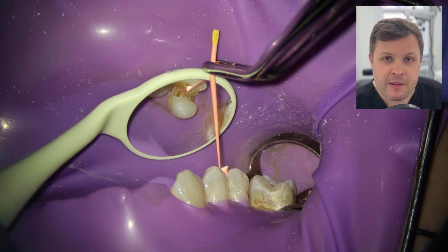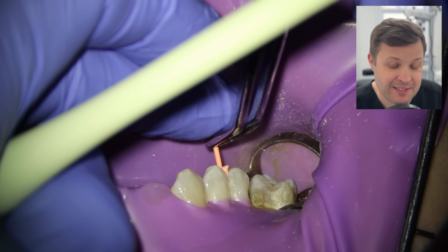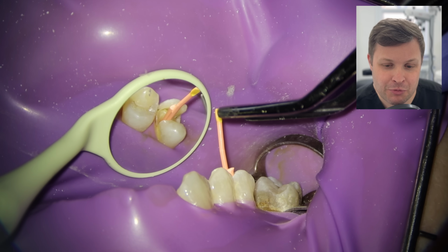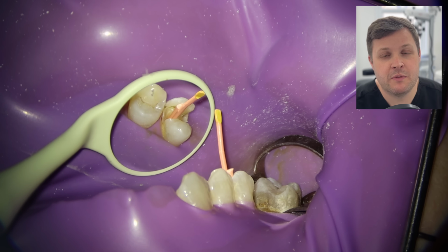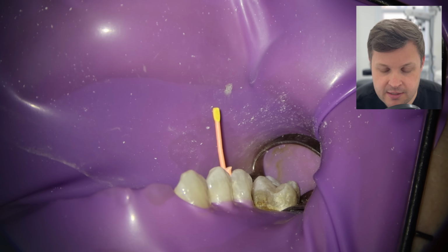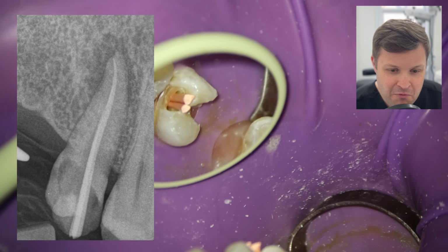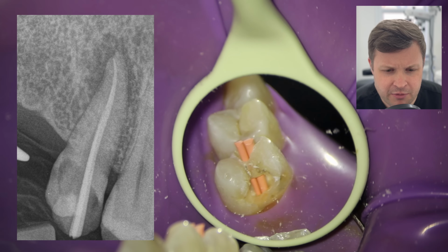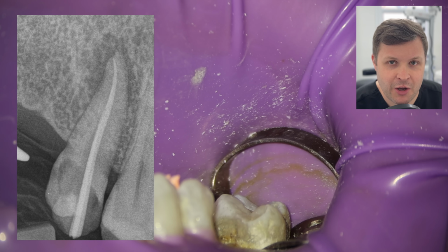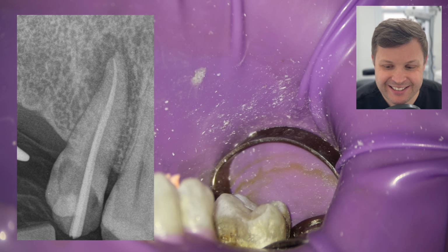But as we fit this GP cone in the palatal aspect of this cavity, this pulp, we can see now that it's a bit short. So we know that this is a single rooted tooth, because if it was double roots, this would fit to length quite nicely. And this is just hitting the 25 GP cone where it's joining. Then we snip off the excess, and we look at the cone fit, and it looks gorgeous. Oh, it looks beautiful. It's going right down the center of the tooth. Also on the cone fit we can actually see the two cones at the CEJ, and it looks pretty neat.